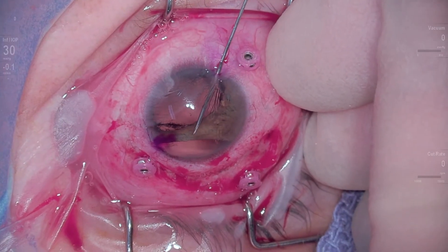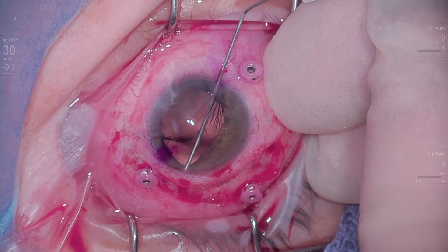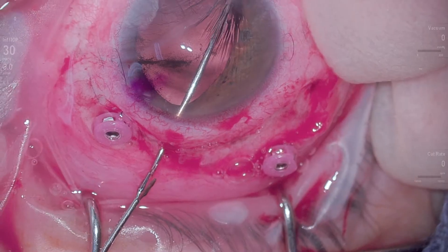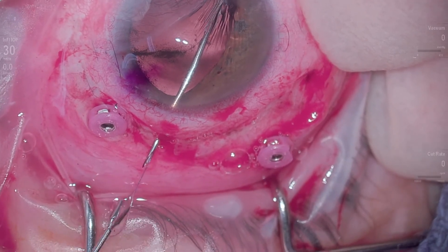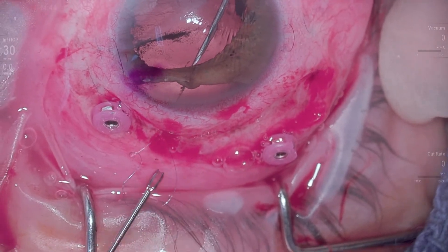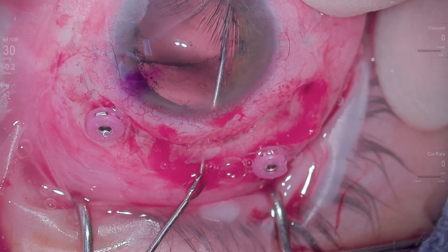I reload my needle and go back in, passing through this iris, grasping a bit of iris there, coming out in an appropriate fashion — just doing the same thing. Once again I'd like to have done this in a full running fashion. I externalize that loose end, not pulling out of the needle tip, but pulling the loose end out and going back in. Now I re-engage my iris, come out again, this time trying to space these bites out a little bit further.